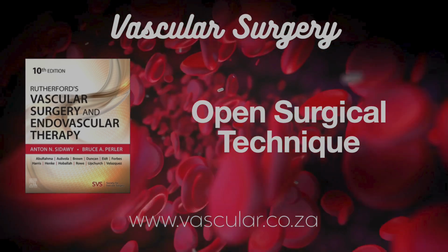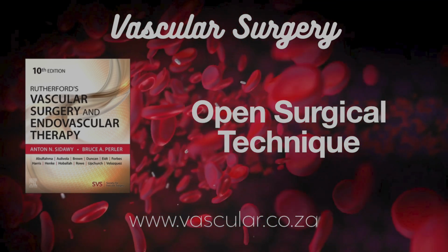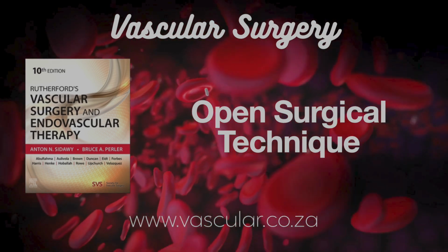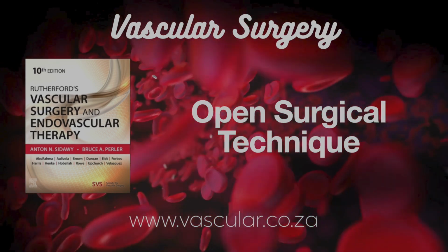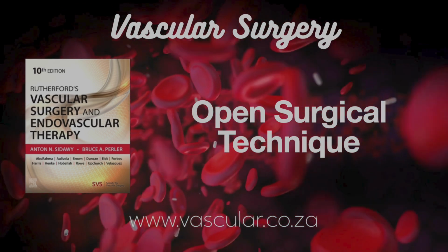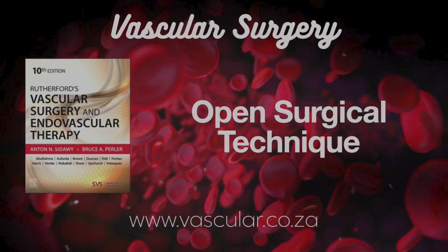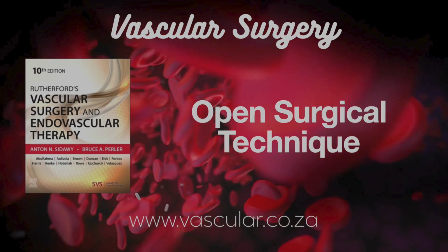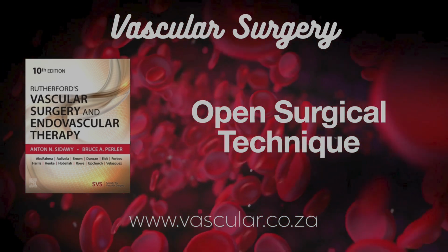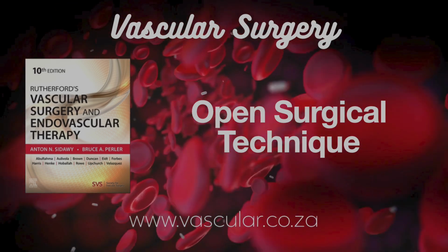What about blocking the artery from the inside? Balloon occlusion, when's that better? Balloon occlusion is a great option when external clamps might be too risky. Like when? If plaque goes all the way around the artery, or takes up more than half the diameter, clamping could easily fracture plaque or tear the wall. So you insert a balloon instead. Exactly. A compliant balloon catheter, like a Fogarty embolectomy catheter, or sometimes a non-compliant angioplasty balloon. Insert it, inflate it, blocks flow from within. Safer for the artery wall. Potentially, yes. There are even specialized occlusion balloons for emergencies like ruptured aortic aneurysms.